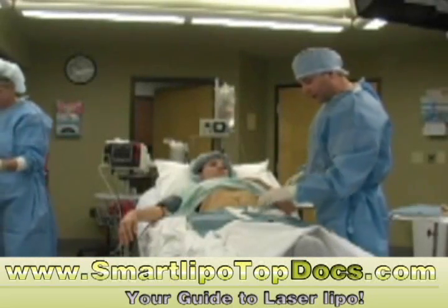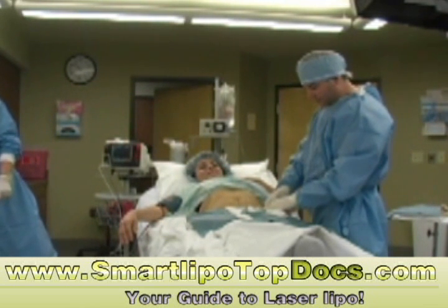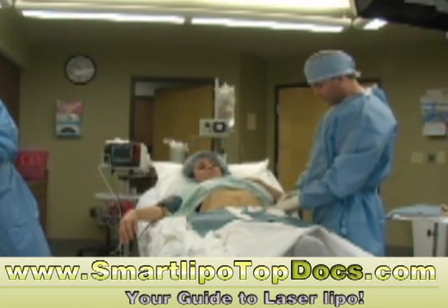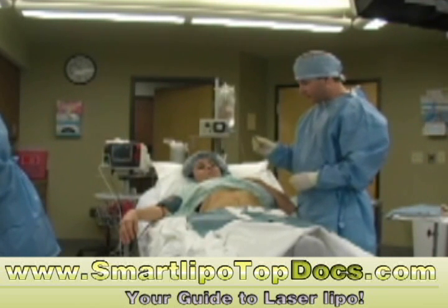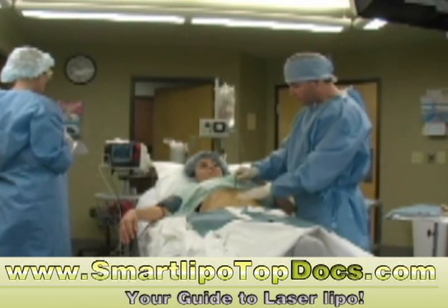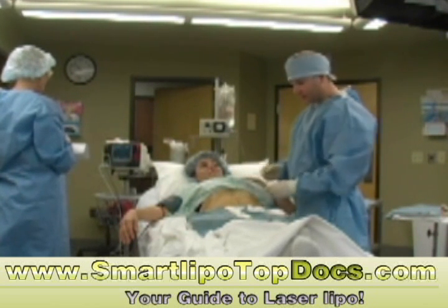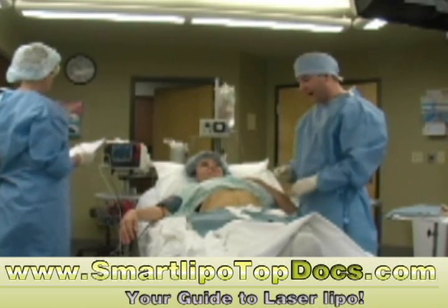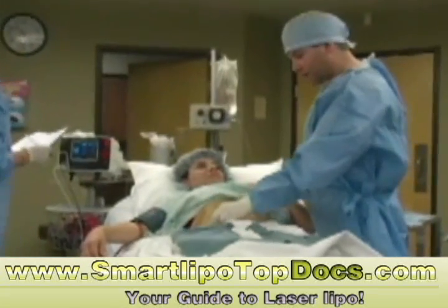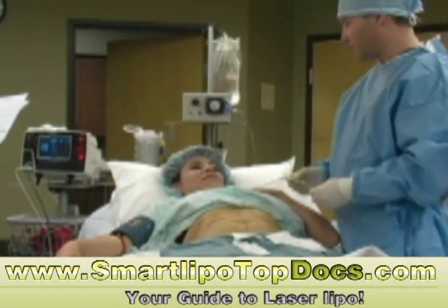Yolanda, we're ready to start making our little incisions. Surprisingly, you're not going to feel these very much at all — just a little poke underneath the skin. We're going to make our incisions with this very tiny little instrument here. That's all the bigger any of the incisions are going to be on your body. We work through very small holes when we remove your fat. It's important not only to do an adequate job removing the fat, but part of a good liposuction surgeon's duty is to make sure they don't leave any track marks, ensuring we cause as minimal amount of scarring as possible.